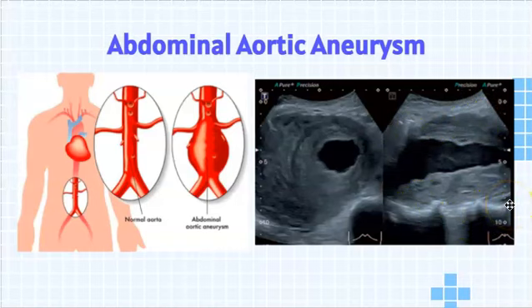If an aneurysm is seen, it should be followed to measure the length of the dilation and to note the position of the renal arteries in relationship to that aneurysm. Here we have our normal aorta, and then here we have our focal outpouching of that aneurysm, and we can see it lies just inferior to those renal arteries here. If you are scanning an aneurysm and you're having a hard time finding the renal arteries, you can put color Doppler on to help. And then once you have these images taken, you're going to want to measure once in the sagittal plane and then twice in the transverse plane.